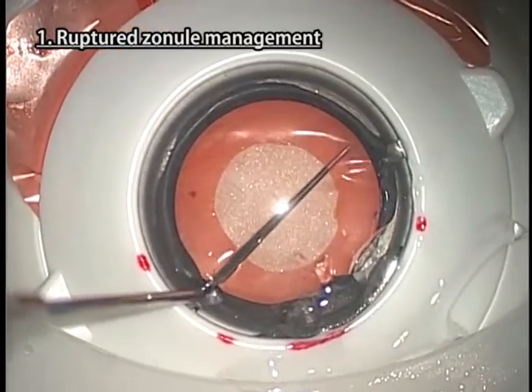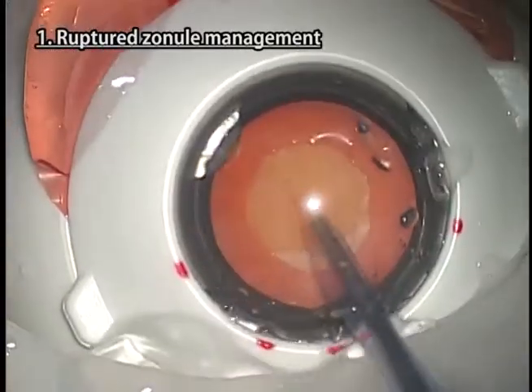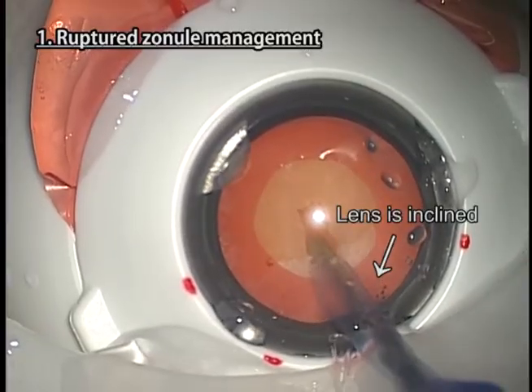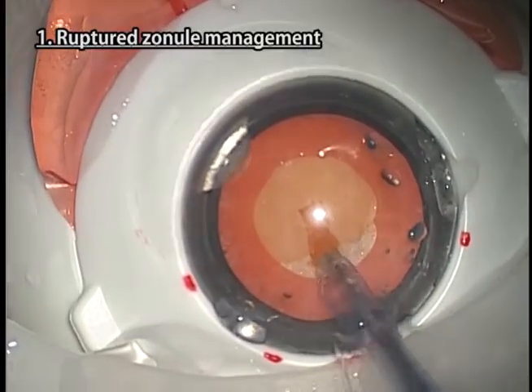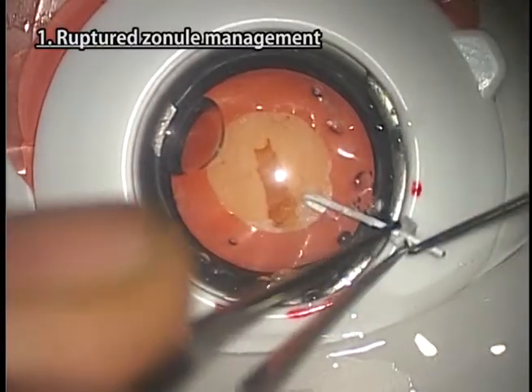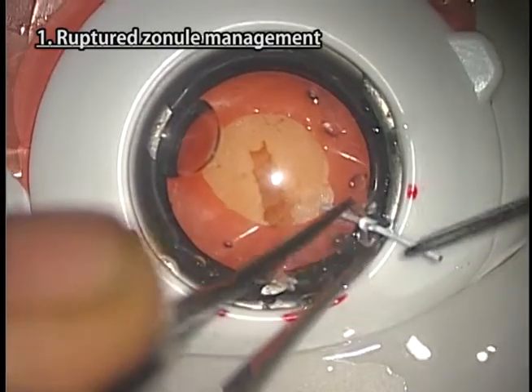CTR insertion using an injector can also be practiced. Apply two or more iris retractors or capsule expanders where the zonules are missing to support the capsular bag.